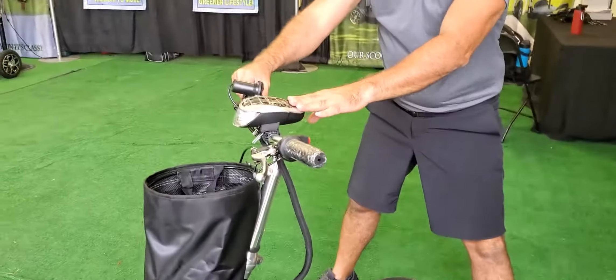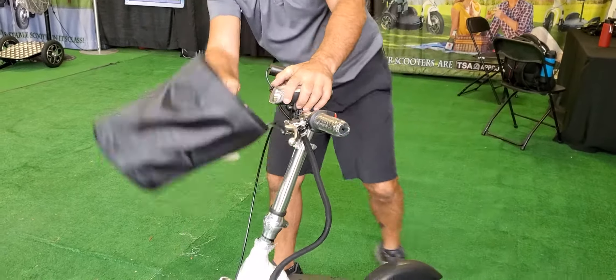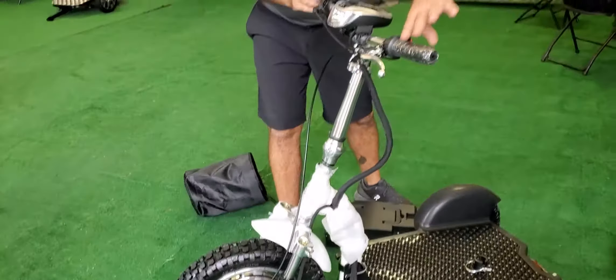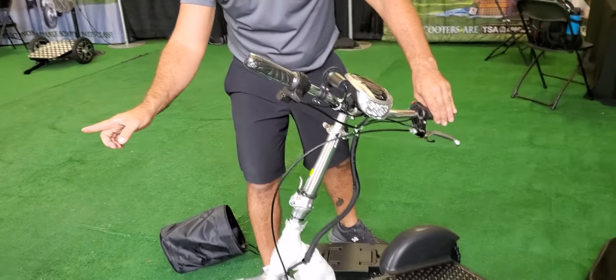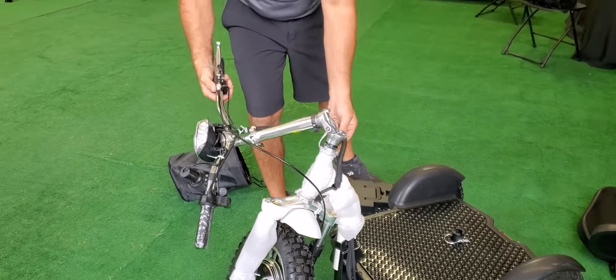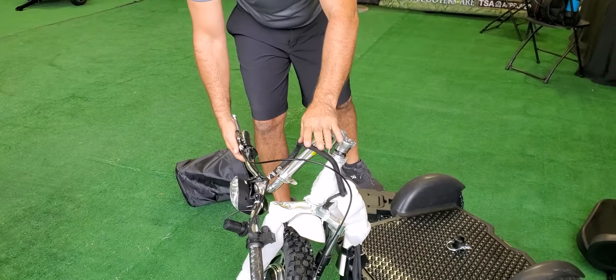Whenever you're folding this over, always take the basket off first. You're going to turn this with the hinge facing outwards, flip this lever — that's going to fold that forward. Always put that cord on the outside there.